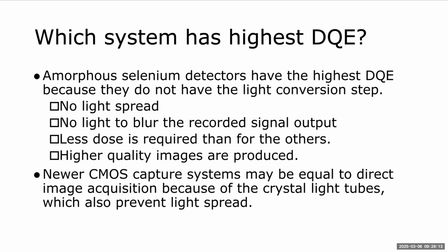However, they're working on that. Newer CMOS capture systems can be equal to direct image acquisition because of the crystal light tubes, which also prevent light spread. So this is constantly being improved upon.